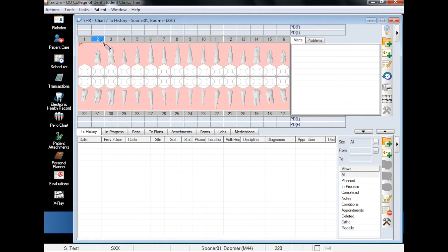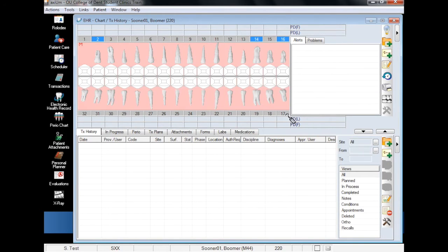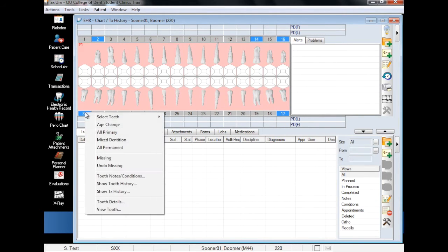If several teeth are missing, it is possible to mark multiple teeth at once by clicking on each missing tooth number and, as before, right-clicking and choosing Missing.